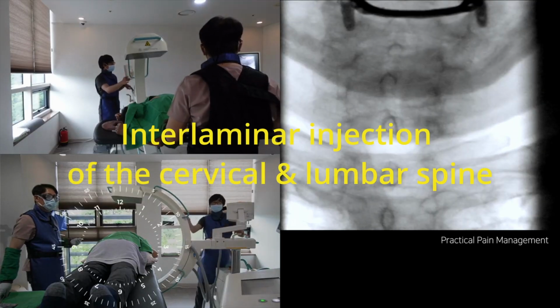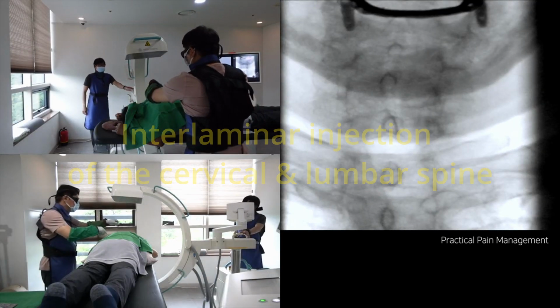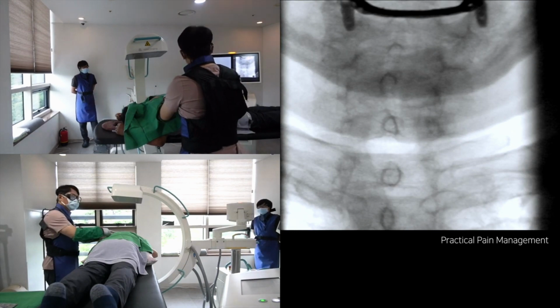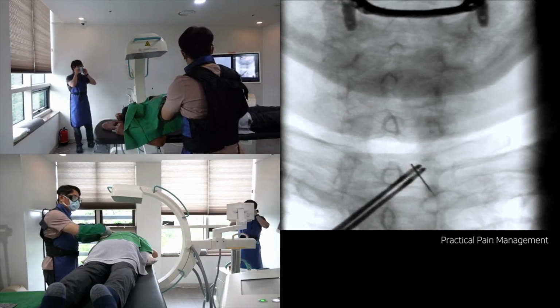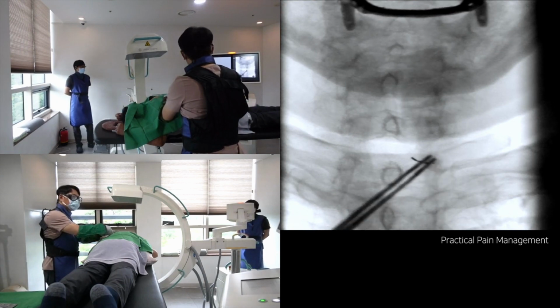Interlaminar injection in the cervical and lumbar spine. An interlaminar injection is a common interventional procedure to alleviate cervical and lumbar spine pain, either radicular or discogenic somatic pain. Also, it covers a broad range of spinal pain because it spreads the steroid and local anesthetics into the wide area of epidural space broadly.